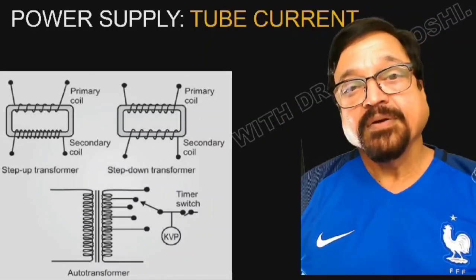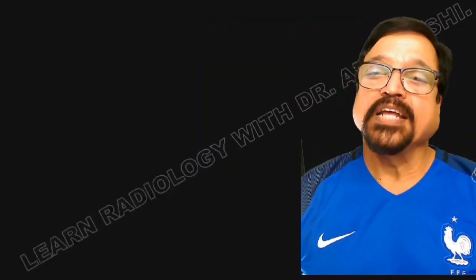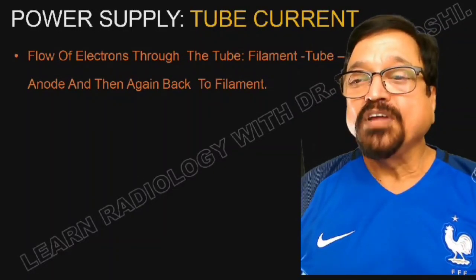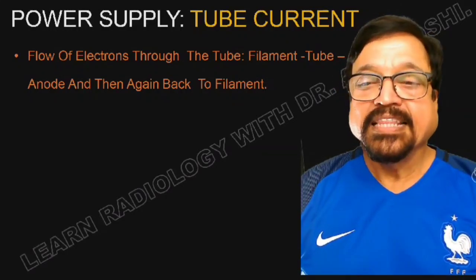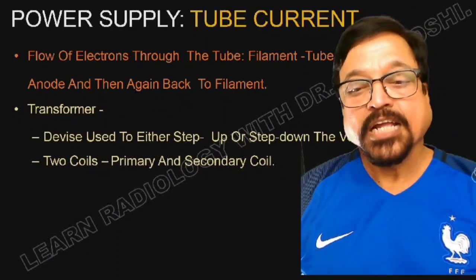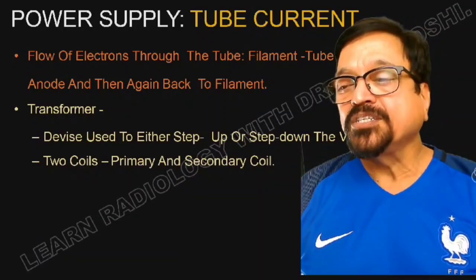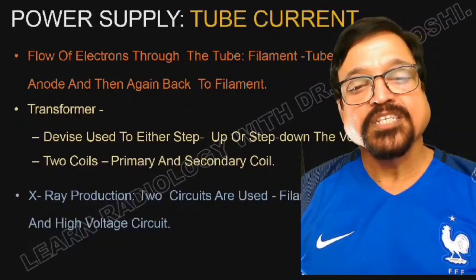Now tube current: here we are shown primary, secondary. Why is the tube current given? Tube current is given to heat a filament and also for the exposure purpose. The flow of electrons goes through the tube, from filament to anode, and then back again to the filament. For that you have a transformer which is used either as a step up or step down transformer.